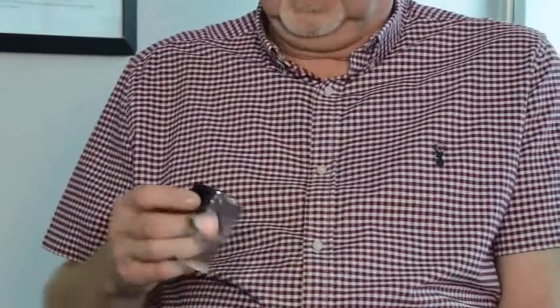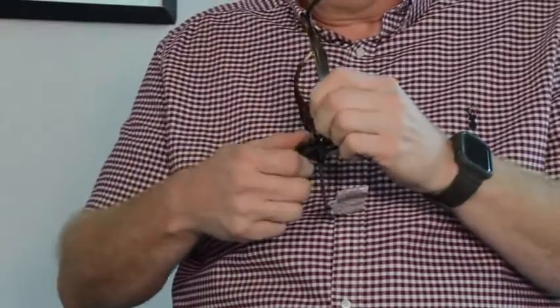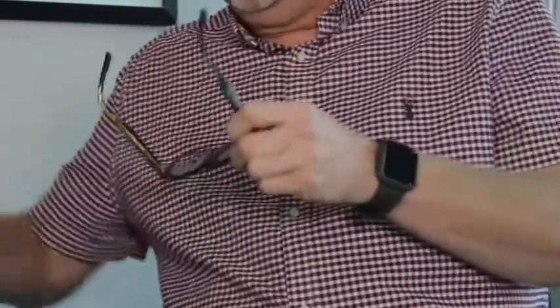Yeah, this is where I ended up with optics really. I found this and bought one of these. It's basically a magnifying glass. So I've got my glasses on today so I can show you this. It clips on and then I'm ready for surgery. Yeah, you look like that dentist that I dread. I'm going to take that off. I got something like that because, well, you'll have seen me do it, I've got both hands free.